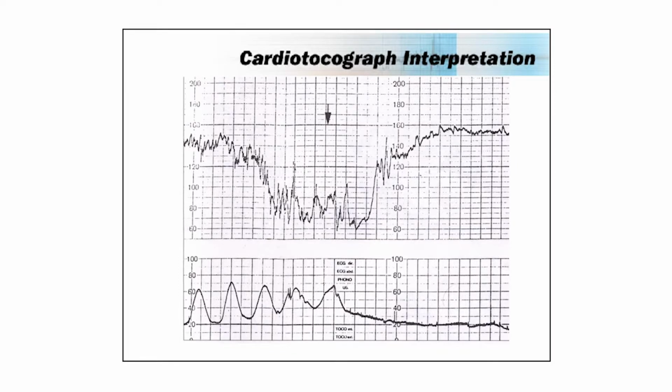So this mother gets resting tone here and doesn't achieve resting tone again until another 7.5, 8 minutes later, where resting tone is achieved here. See the rising resting tone. What's the cause of that? What happened here? Oxytocin. So you're all saying syntocin or oxytocin. You've all seen this happen, I'm sure, with oxytocin. So what then is the black mark?